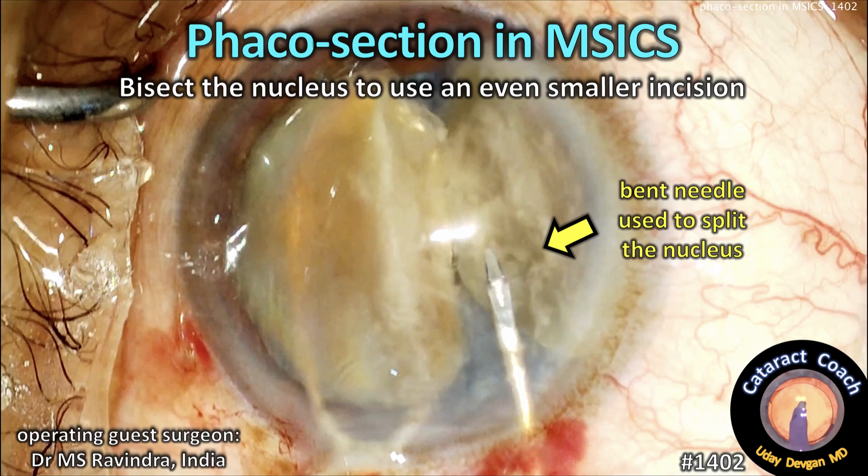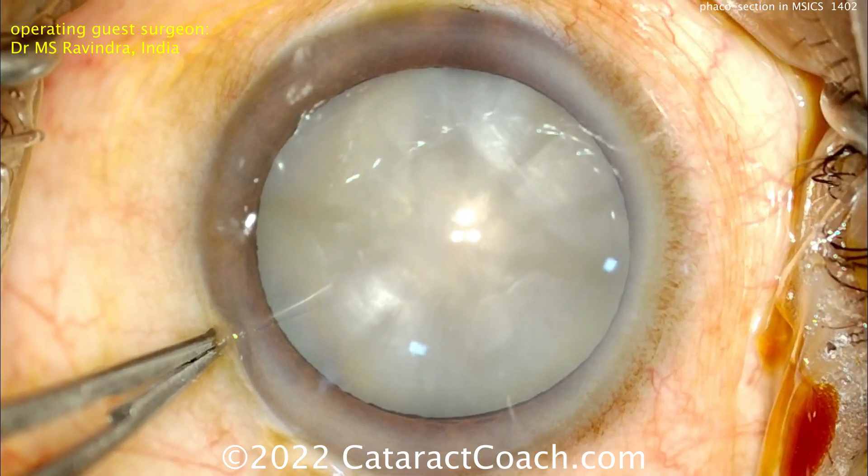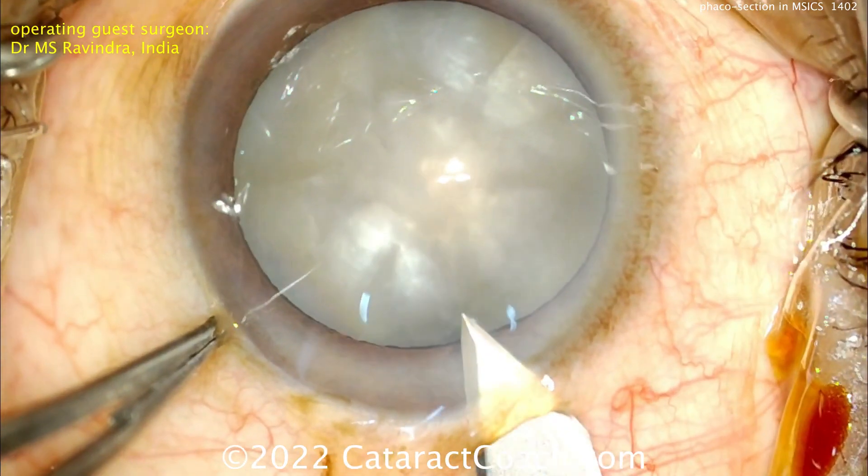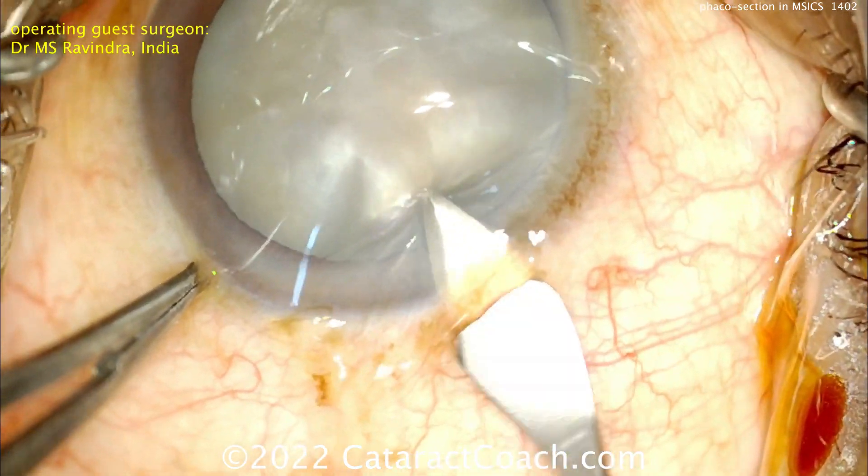From cataractcoach.com, this is the FACO section in MSICS — bisecting the nucleus to use an even smaller incision. Our guest surgeon is Dr. MS Ravindra from India. Watch this technique: making a good tunnel length there — look at that tunnel length.